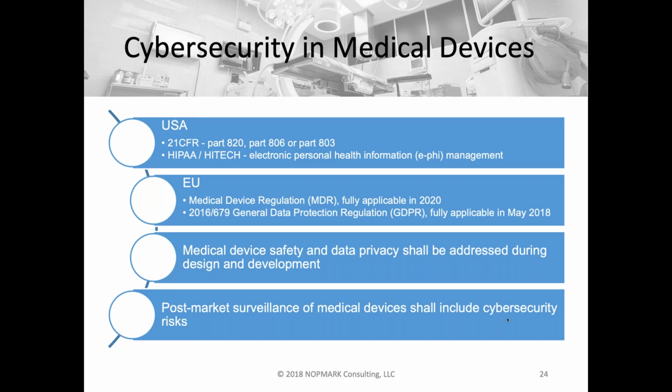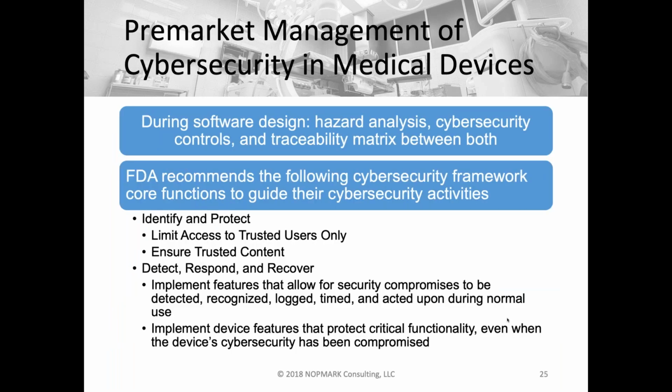But it's expected that both the software development team and the software testers, who are part of that software development team, are assessing security vulnerabilities, and both updating the software and testing the software to show that it is not vulnerable to whatever is the latest malware, virus, or attacks out there in the field.